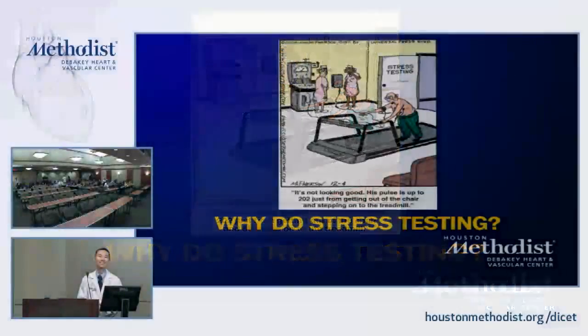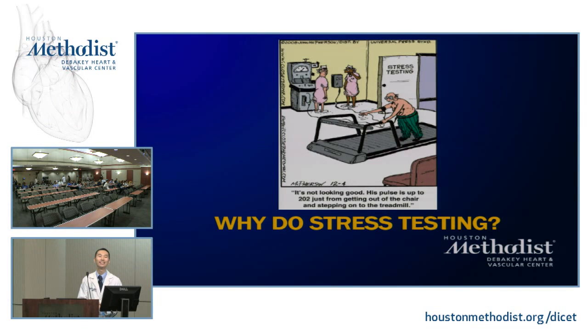Brian? Patient has chest pain or something, you're looking for evidence of ischemia. So ischemia evaluation, that's one good reason. Any other reasons? Prognosis, functional capacity. Yes. Anything else, Basil? For CMR specifically or just in general, yes. Chronotropic competence is something unique to exercise testing, but yes, you're right, Nadine.